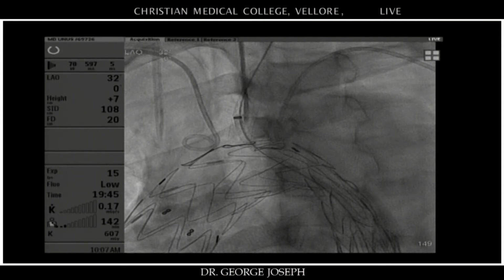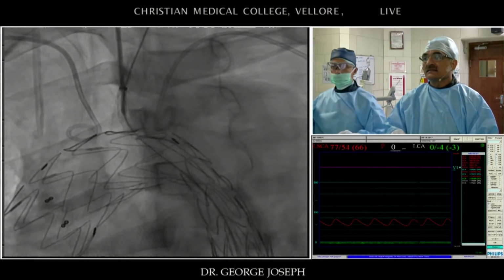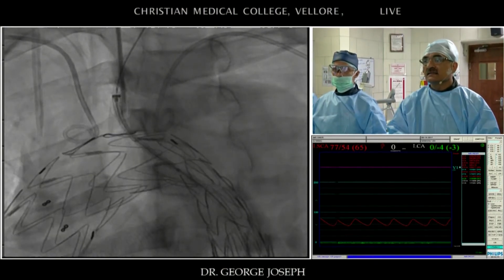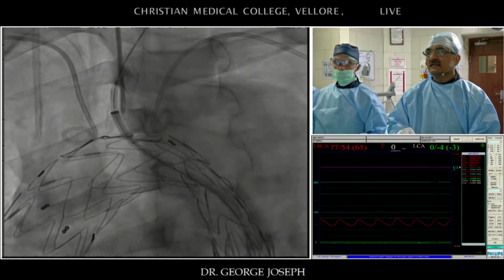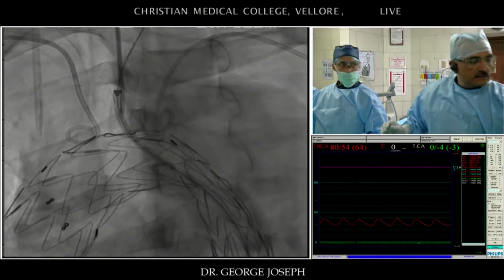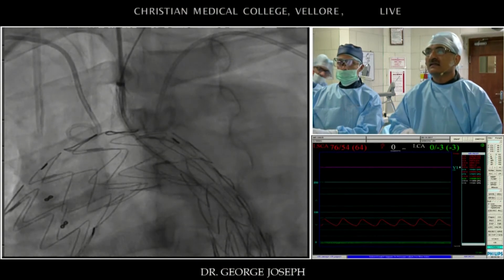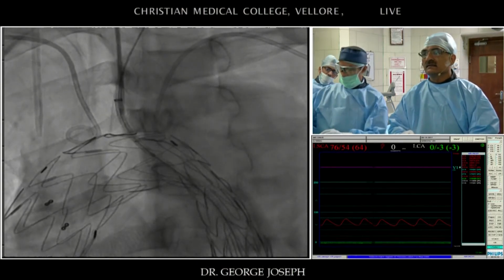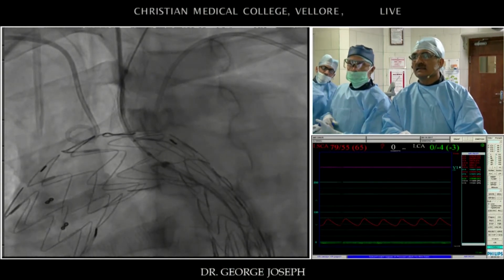All right, so here comes the same covered stent again, but this time I've gone a millimeter bigger, and I will have to project into the aorta again like before, but it's pushing that stent up. I think that we need to just feed the wire in a bit. Okay. Yeah, all right. Okay, go. Yeah.